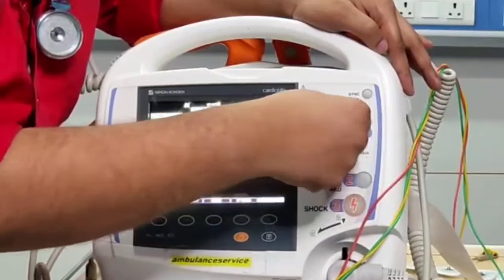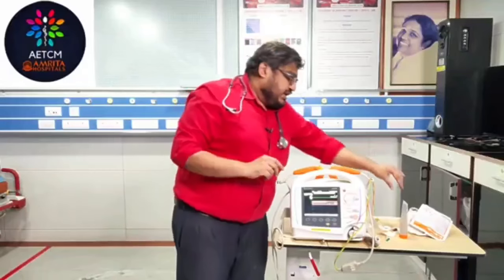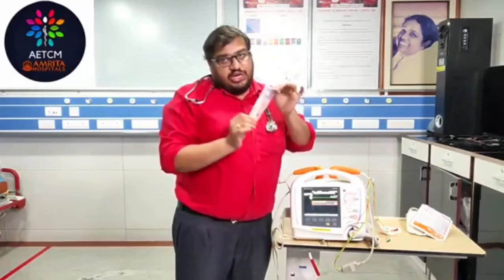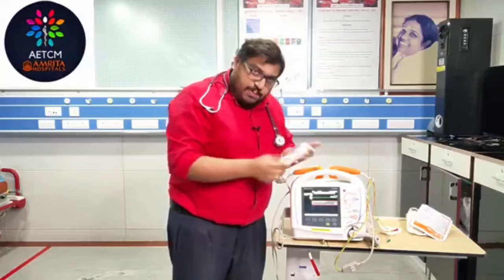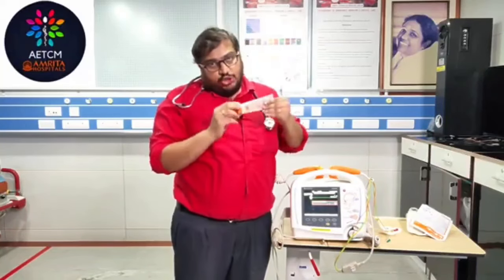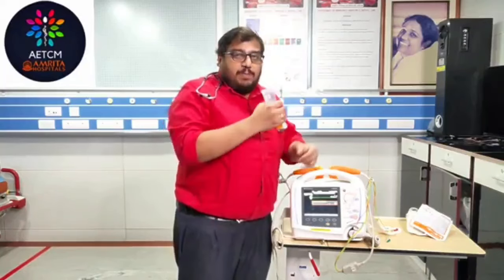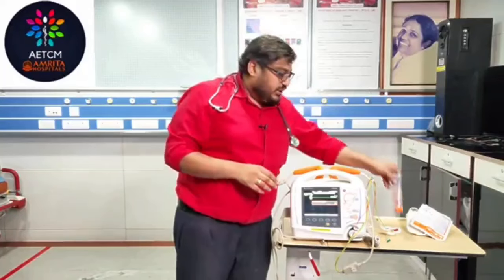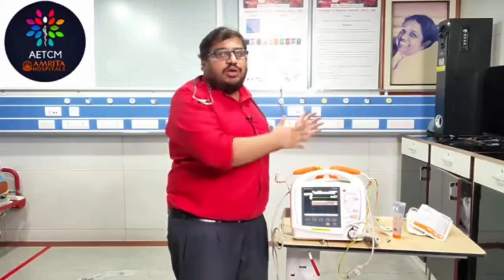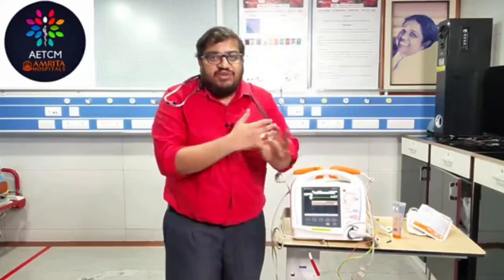So once you select the amount of energy to be delivered, what do you need to do? The next thing that you need is something called gel. You have to have a gel, because you need very good conduction between your paddles and the skin, and also the skin should not burn while you are giving your shock. So you need to apply this gel between the paddles and the skin. Both the paddles you need to apply. This is the other thing that you need to arrange, and it is obvious that you should be doing this in your resuscitation area. So all your resuscitation equipment has to be there. You are monitoring NIBP, oxygen availability, everything needs to be there.